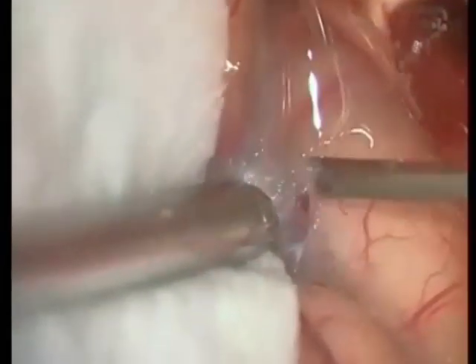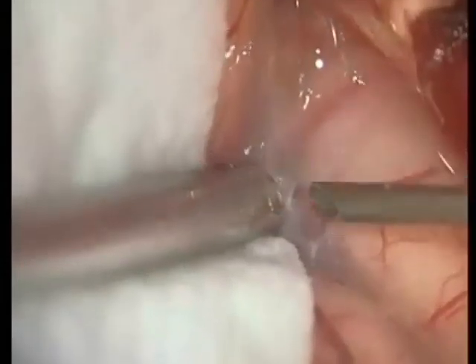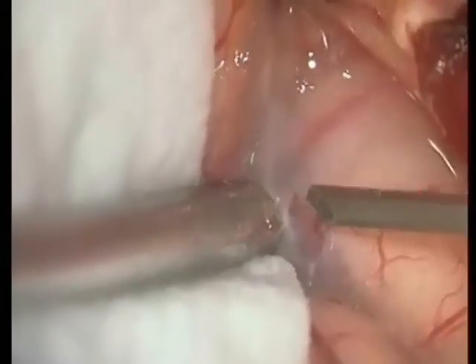After a right-sided lateral supraorbital approach, we see that this patient does not have a sylvian vein running along the sylvian fissure. The sylvian fissure is entered rather proximally. The aim is to arrive directly at the aneurysm site.